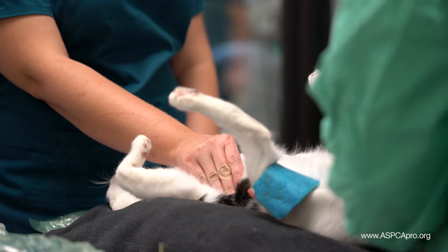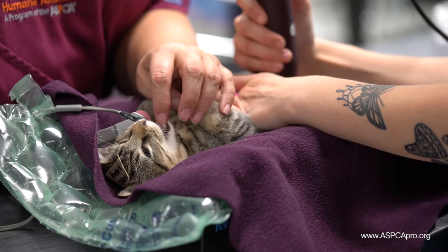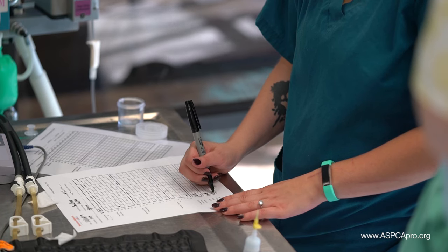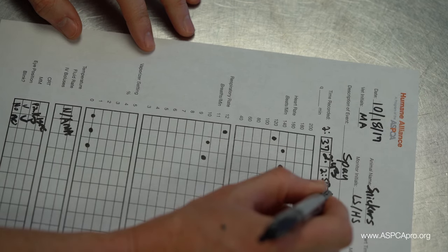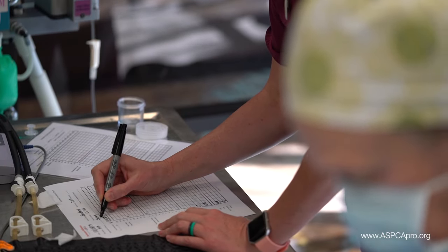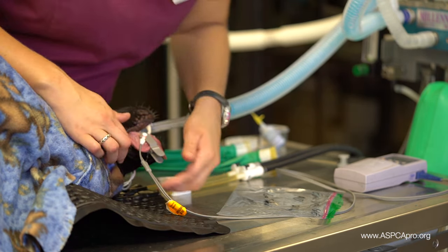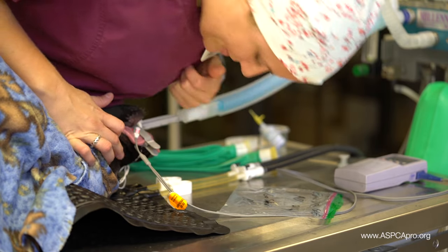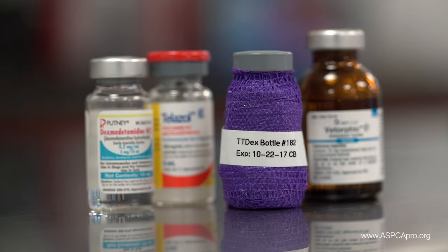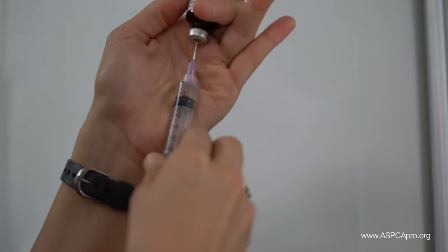Each staff member on a team should check each patient at minimum every two minutes, resulting in multiple checks on an animal per two-minute period. An anesthesia monitoring chart may be utilized to demonstrate trends and vital parameters, facilitating the monitoring of one patient by multiple people. It is important to evaluate multiple vital parameters when determining anesthetic depth, as opposed to taking only one factor into consideration. Appropriate vital parameter ranges will be dependent on the drug protocols used, as well as individual patient signalment.